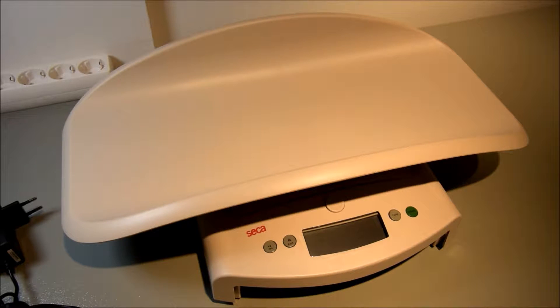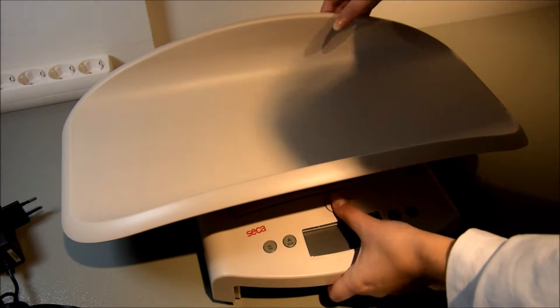In this video we would like to show you the installation and operation of the Seca 354M. To install the scale, take it from the box and place it on a flat and stable surface. Take the tray off by pushing the button in the middle.